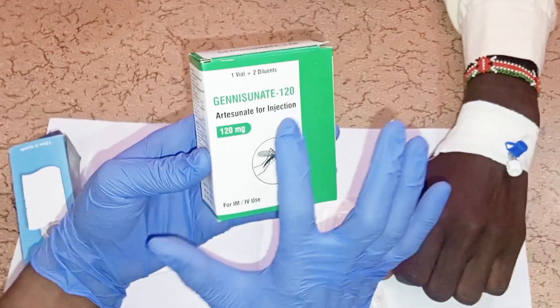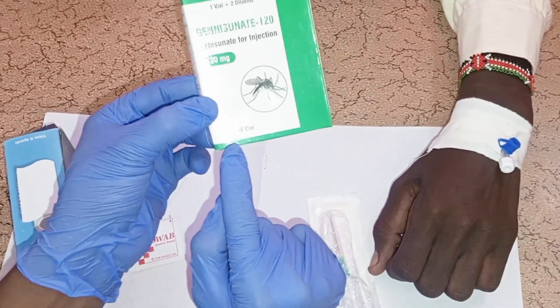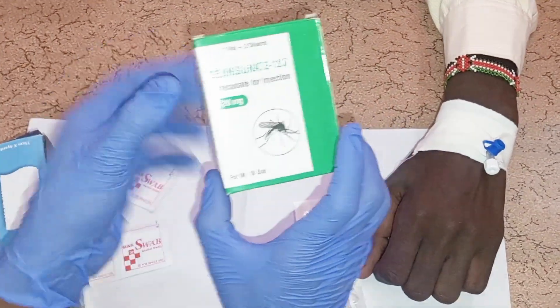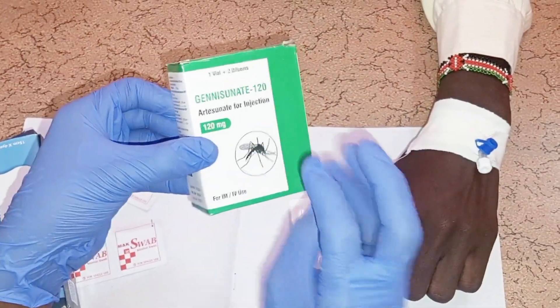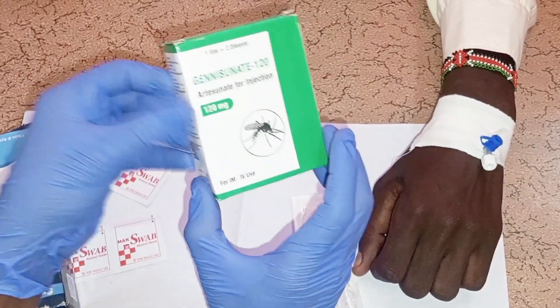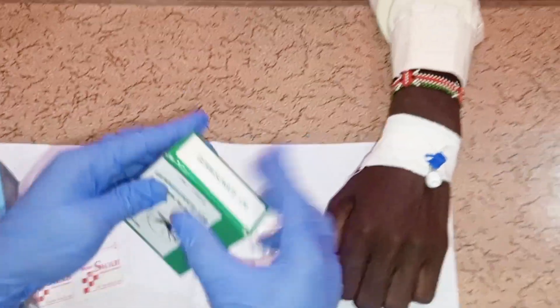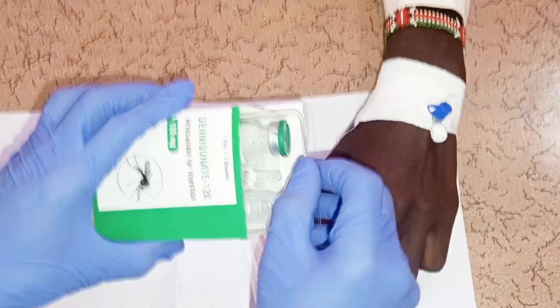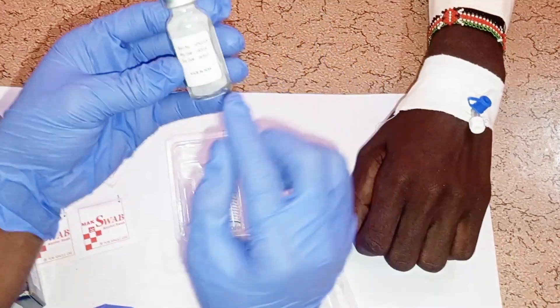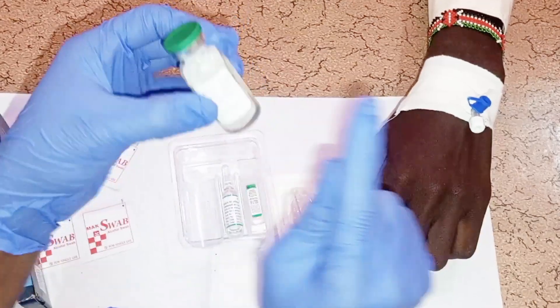Confirm the method of administration — IV or IM use. For intravenous use, dilute all the sterile water for injection into the vial. For IM injection, reconstitute with only 4 ml of sterile water. Remove the drug from the packaging — you will find the vial containing white powder for IV or IM use. Check and confirm the expiry date of the drug.